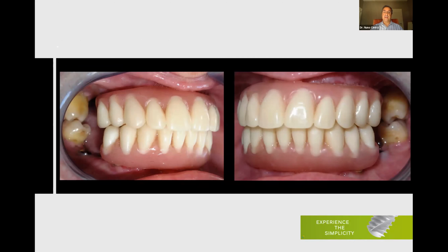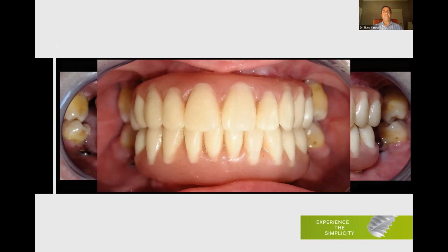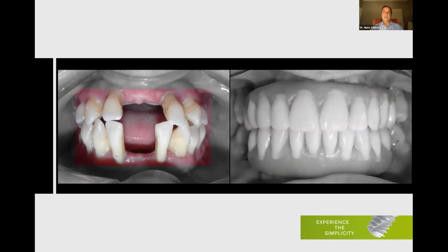This is 10 days post-op when we remove the stitches. And as you can see, we have 2 provisionals with 10 teeth only. So we reduce the cantilevers during the healing process, during the first period of healing, when we are using the provisionals. And this is the kind of provisionals that we deliver on the day of surgery. So we can go from a situation like this to a situation like that on the same day. These are still provisionals. From this to that on the same day.